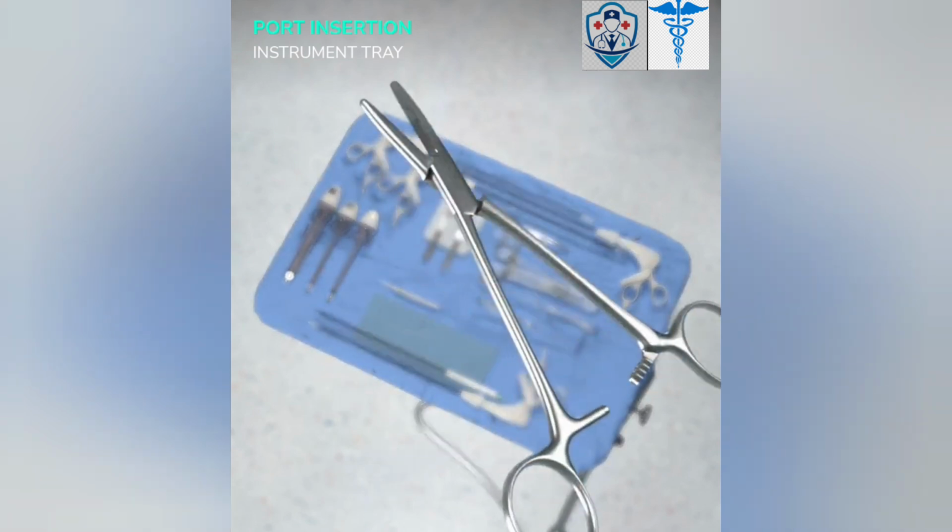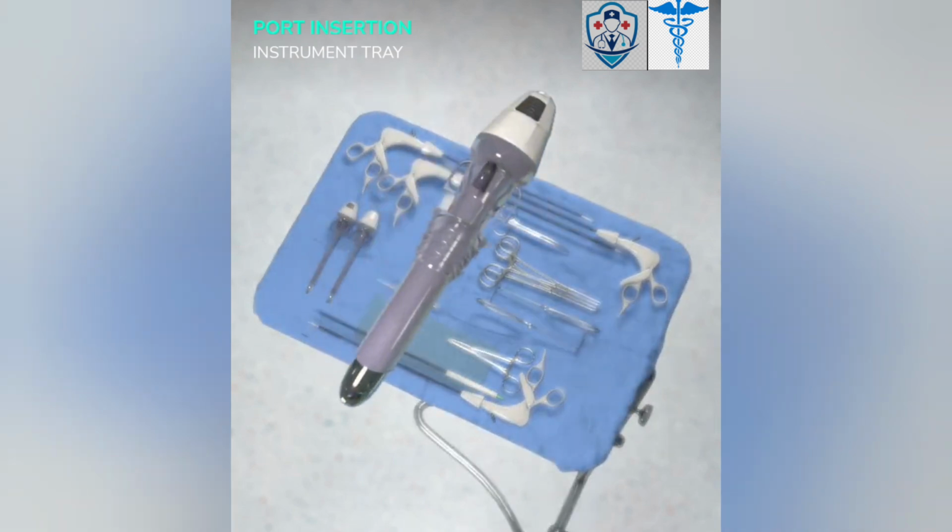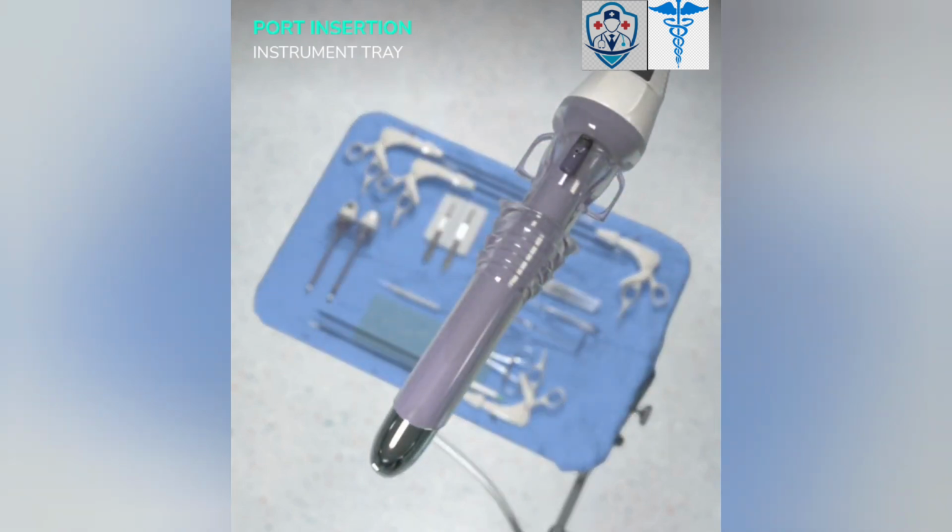The needle holder should have ratchets to allow the instrument to lock the suture in its jaws. The jaws of a needle holder are short and crosshatched. The needle holder should grasp the needle on its body. All sutures are passed to the surgeon in needle holders. The Hassan port has a blunt tip and wings to anchor the stay sutures.